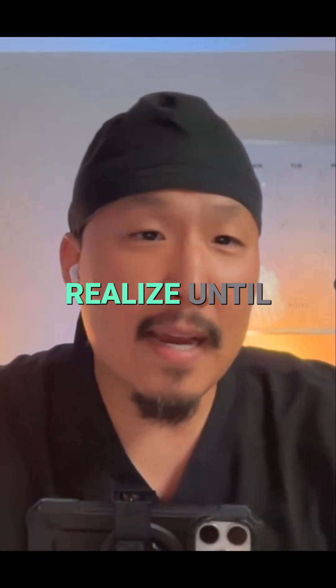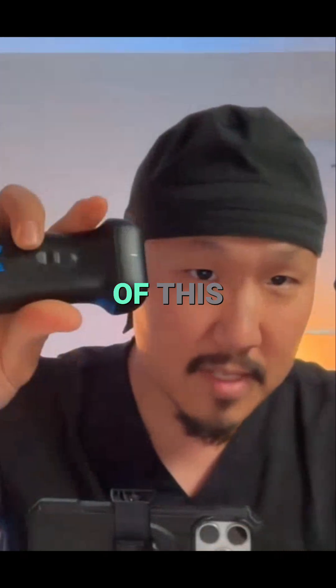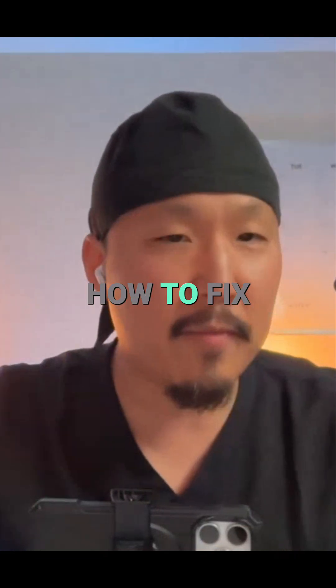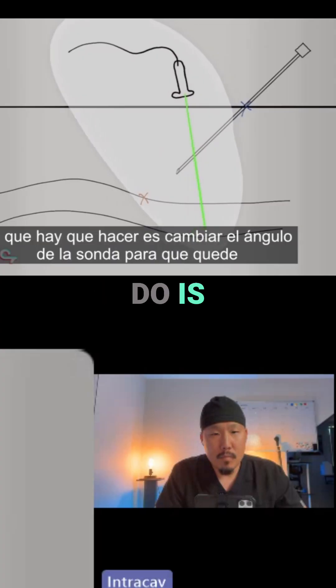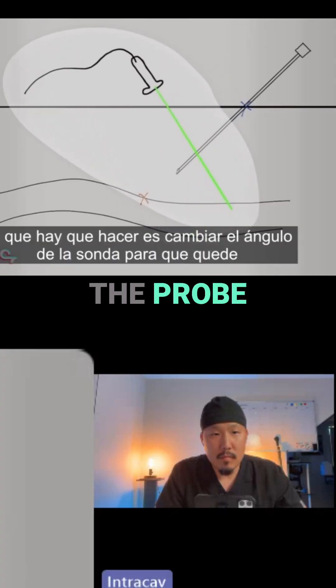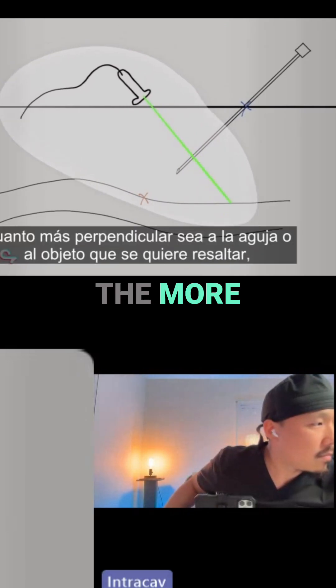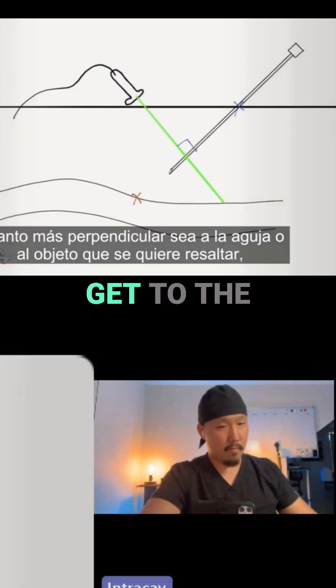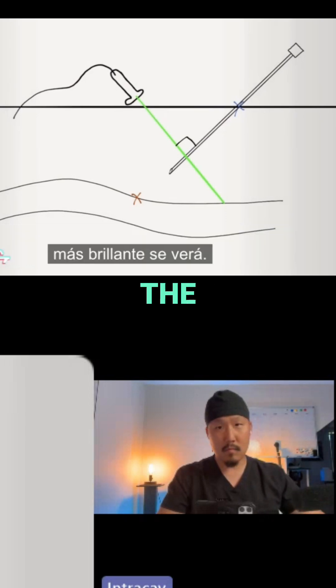I did not realize until I understood the physics of this device how to fix this issue, and I'll show you a video for it. What you need to do is change the angle of the probe so it's more perpendicular to the needle or the object you're trying to highlight — the brighter it'll get.